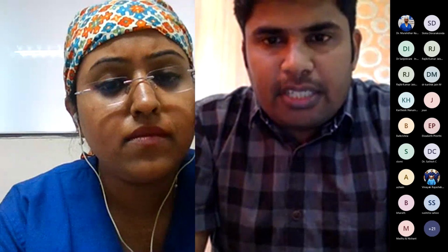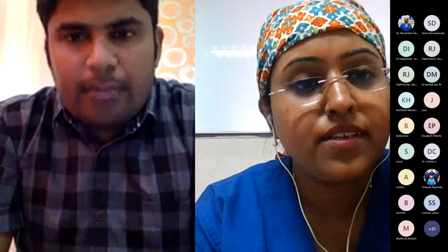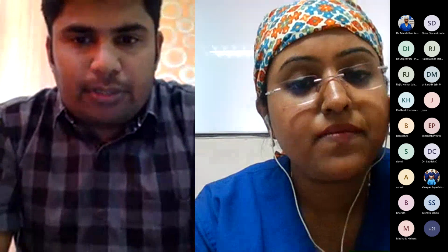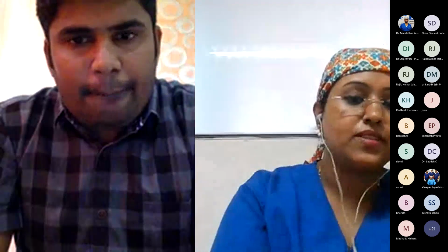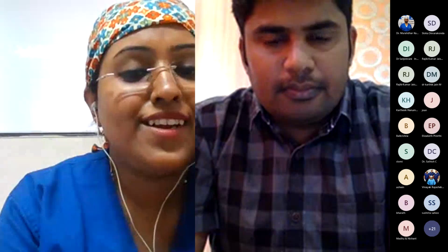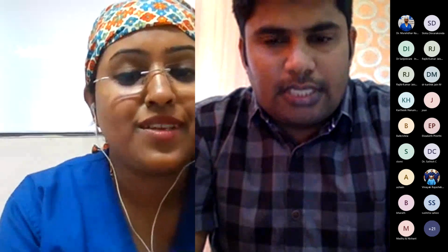Yes, I agree with you, ma'am. For TAVI, the recommendation is not transesophageal or transthoracic; it is MDCT, multi-detector CT, combined with echo. So I totally agree. And even for the coronary measurements, CT scan is more reliable. And obviously for any 3D, it has to be good. That again comes in.